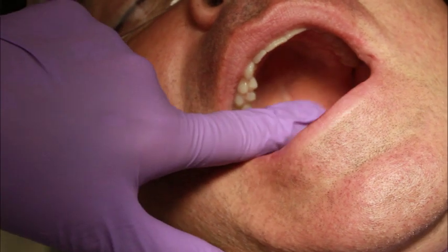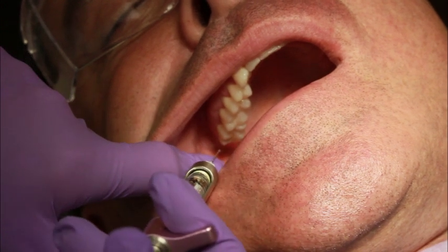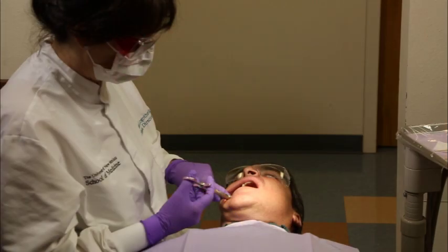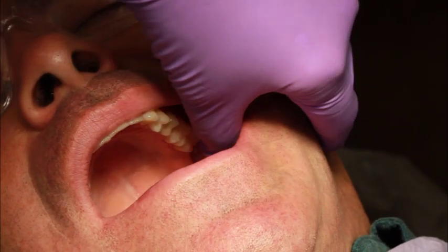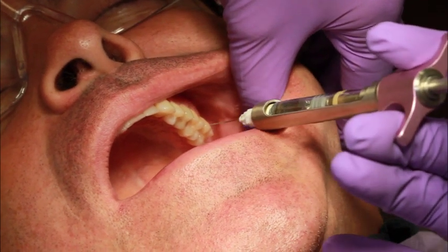Establish a fulcrum by resting the syringe on the index finger or thumb that is retracting the cheek to ensure that the syringe is backward at a 45-degree angle from the mid-sagittal plane while the index finger or thumb rests on the zygomatic arch during retraction. Extend the syringe from the ipsilateral corner of the mouth, possibly pressing downward on the lower lip to maintain the angulations. When attempting the non-dominant side, the correct angulation may be harder to ascertain from across the patient's face.